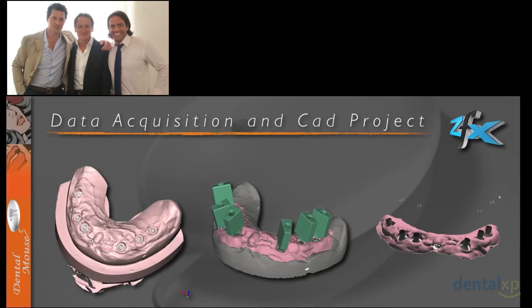And you can see that you can superimpose this picture, you can sectionate them, you can have all the model, you can have only the implants, or, as you can see on the right side, you can evaluate only the gingival tissue. So basically you can evaluate exactly what you want, and you can do trials, you can replace them, you can start from scratch if you think that you made a mistake. So you have much more control in this way.